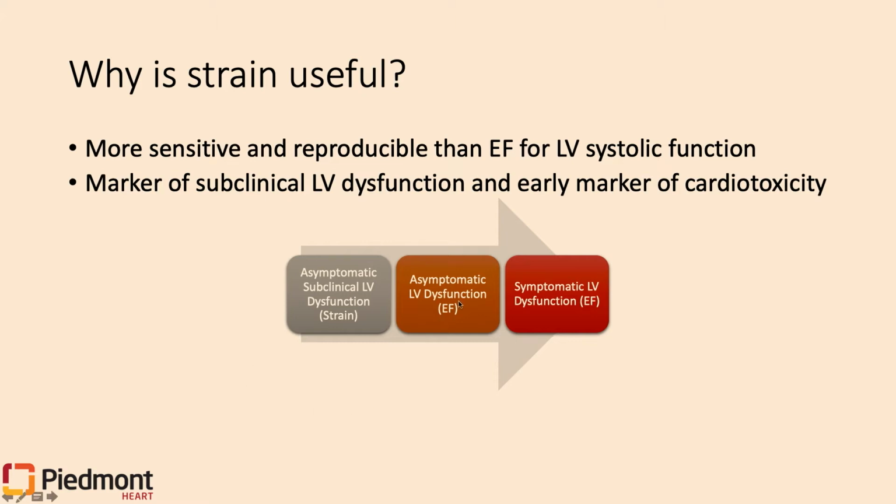various reasons. But even more optimal than that would be to catch the patients who don't have symptoms, don't have signs of LV dysfunction by EF or by visual assessment, yet there is some warning sign that there may be challenges ahead due to the acquisition of strain. And that is the goal that we hope to accomplish by incorporating strain into our echoes.